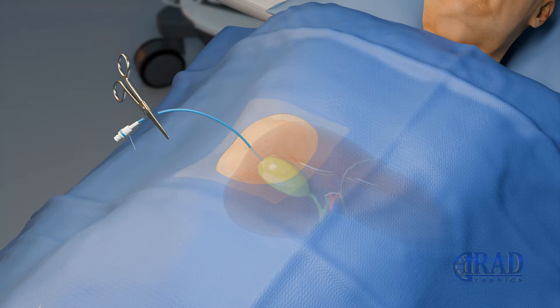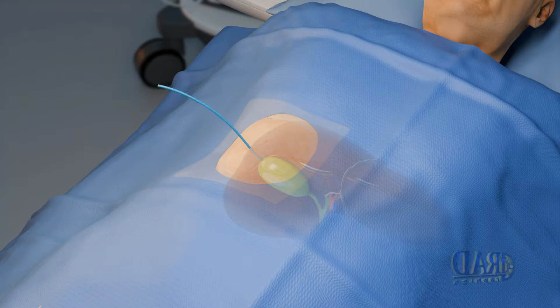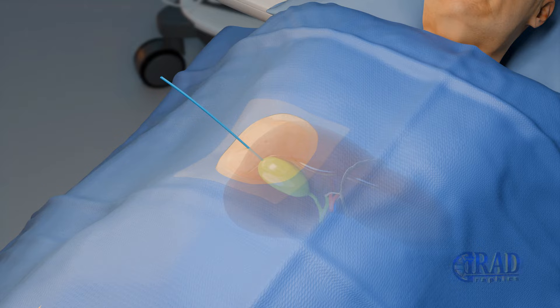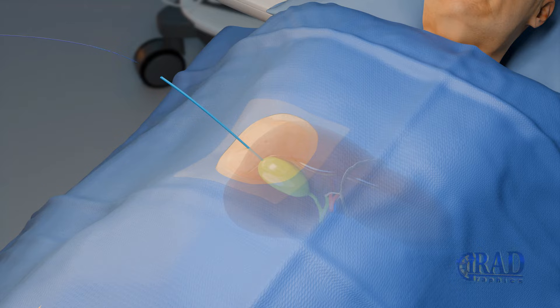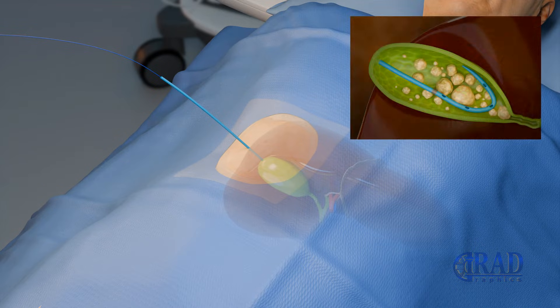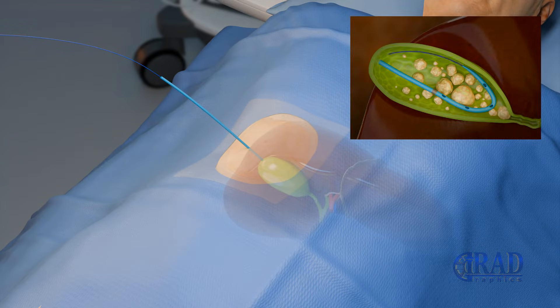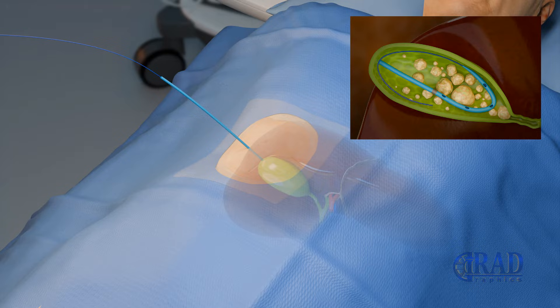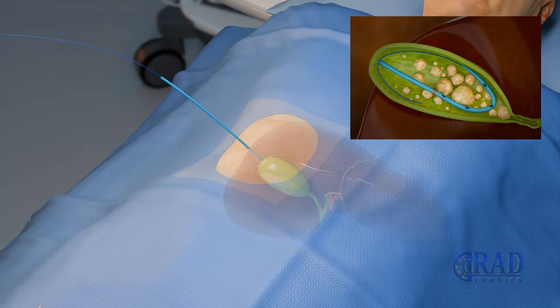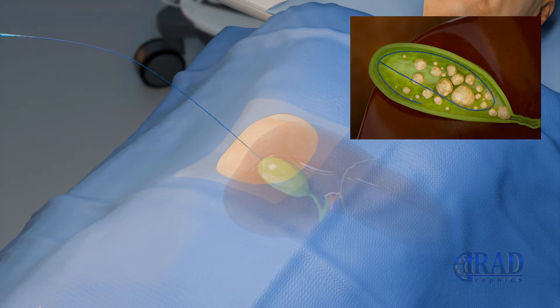Next, the hub of the drain is trimmed using scissors and a guide wire is carefully advanced through the drain into the gallbladder to secure the access. After having the guide wire coiled within the gallbladder, the drain is removed.